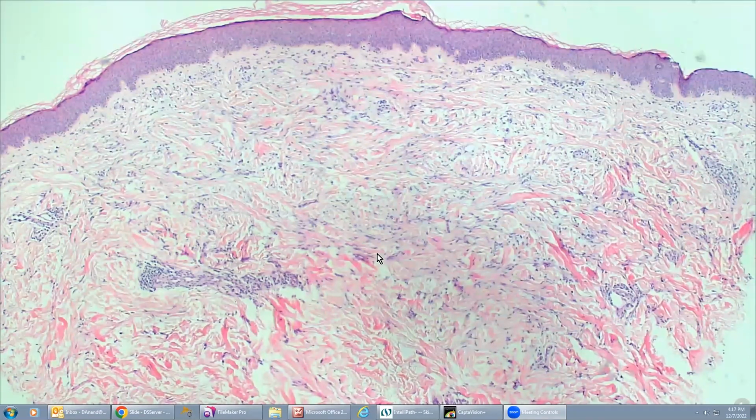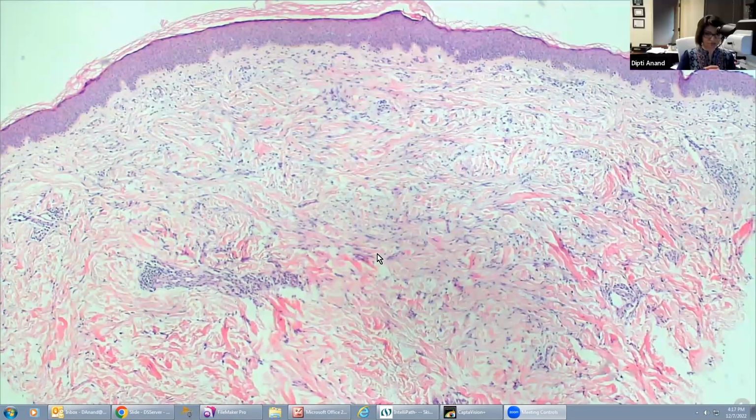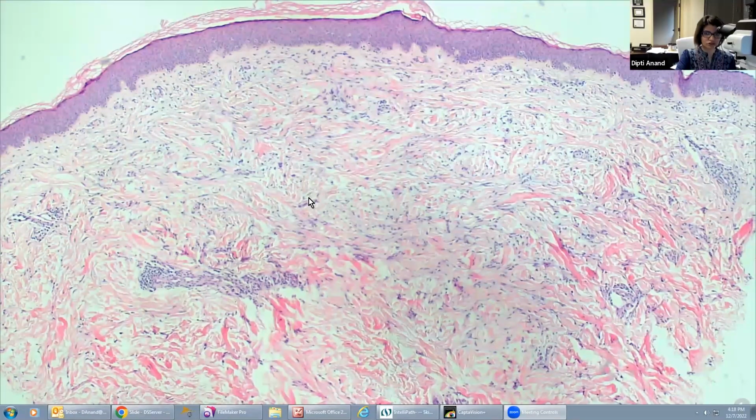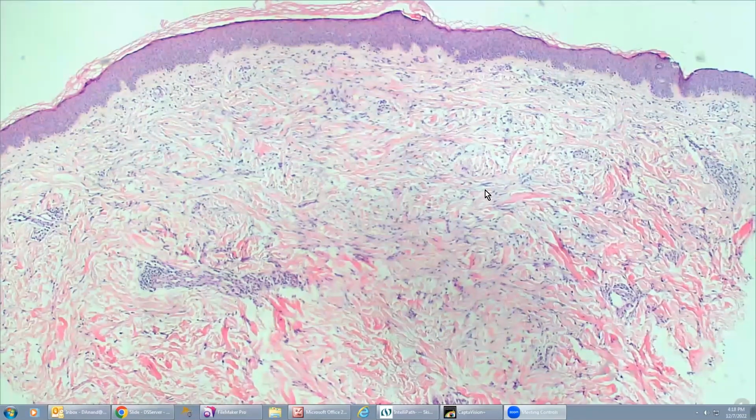So would you say the main way you're differentiating this from GA is just the increased nuclei in the fibroblasts? Yes. Okay. And the discrete areas of necrobiosis are absent. So in GA, the areas that have mucin have altered collagen because it's necrobiotic, so it's broken down. So you will see some kind of an alteration in the collagen architecture. It's not really just thick, but it's broken down. It's necrobiotic. Whereas here it's just thick. It's not broken down, and it's a very random infiltrate along with the fibroblastic proliferation. Got it. Thank you. You're welcome.